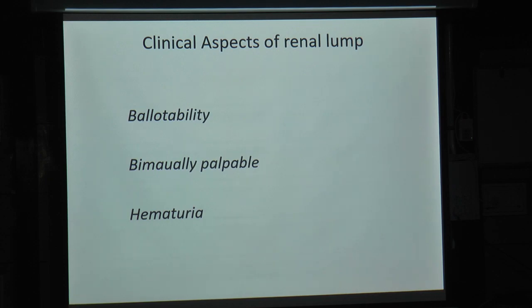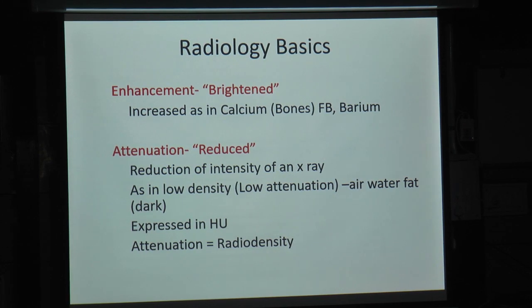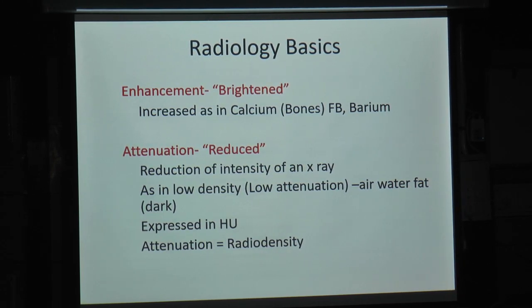So by and large, we have to fall back on radiology to give us what we want to know about this topic. I would just highlight a few points which I thought would help you to sort of juggle through the statements that a radiologist makes on a CT, and that is very important.